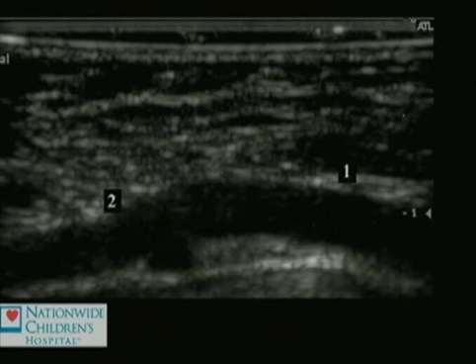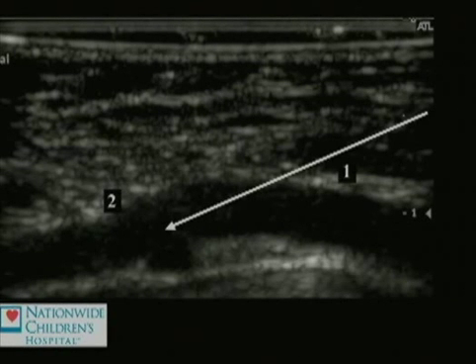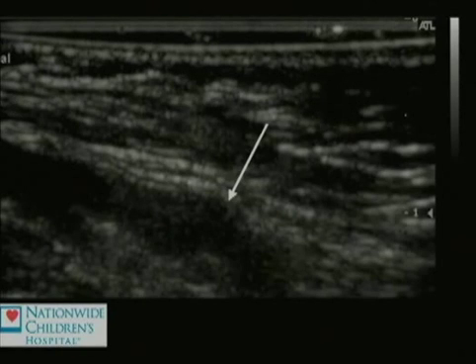As you see in this long axis view of the common femoral vein, the number 1 and number 2 indicators indicate the locations where we prefer to proceed with access first in the ascending portion of the femoral vein, and note is made that the femoral head is below or deep to the vein. So we would approach first in site number 1, and if that fails, then we are left with site number 2. Site number 2 is always our backup site, and as we see with the arrow, it is lined up very nicely in the plane of needle access and the direction of the descending portion of the common femoral vein.